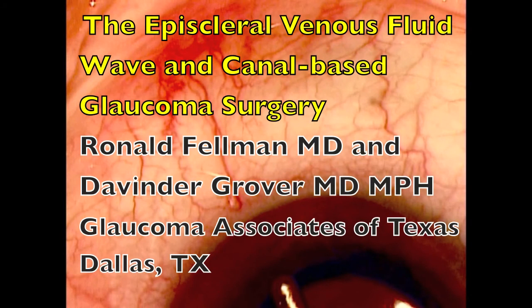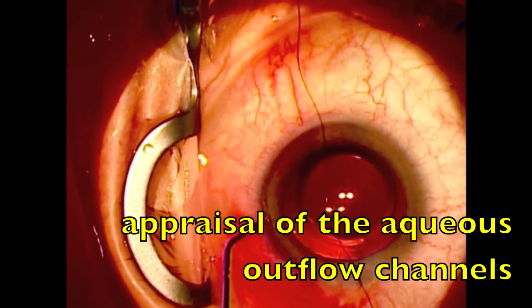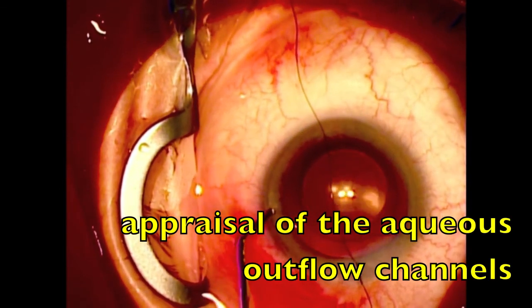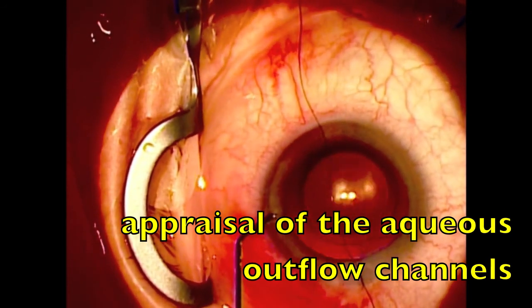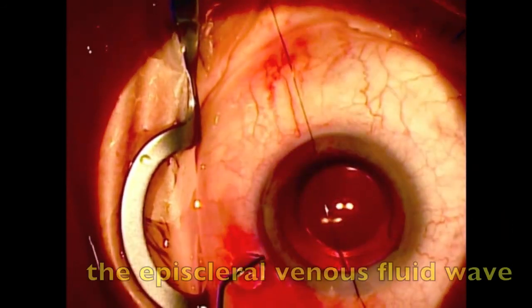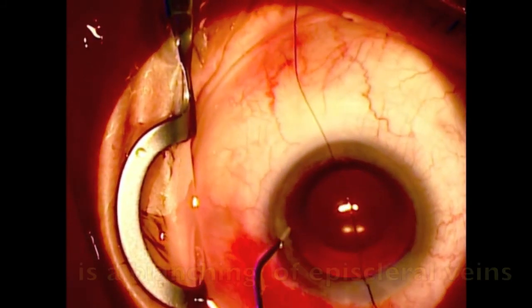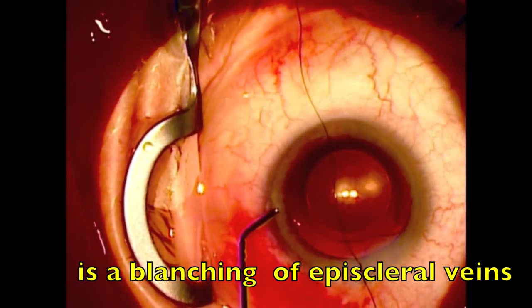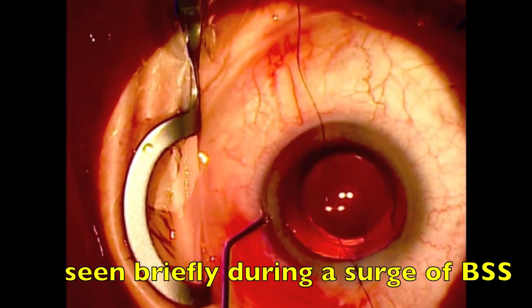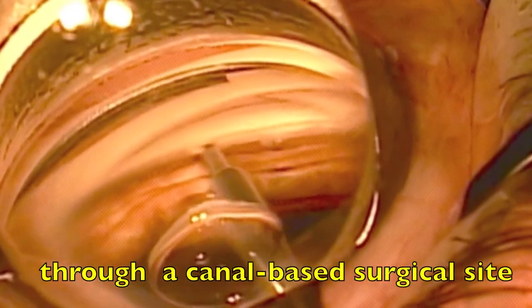The Episcleral Venous Fluid Wave and Canal-Based Glaucoma Surgery. The Episcleral Venous Fluid Wave, seen repeatedly here, is an intraoperative appraisal of the patient's aqueous outflow channels. The Episcleral Wave is a blanching of episcleral veins, seen briefly during a surge of balanced salt solution through a canal-based surgical site.